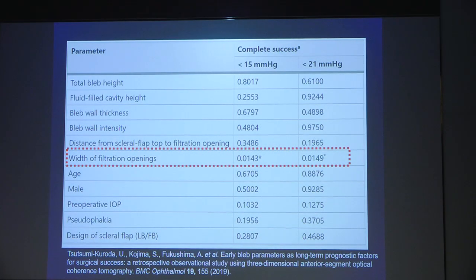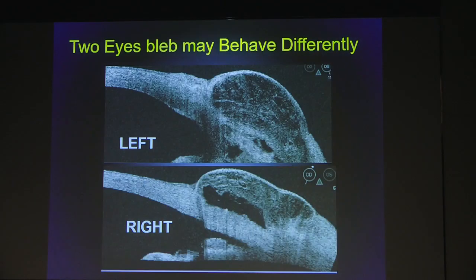Now this is a Japanese study which was published, and in addition to what we have said, they also calculated the opening, the filtering opening, which is seen from inside. And the larger the opening, the more is the success. That is what they also concluded.